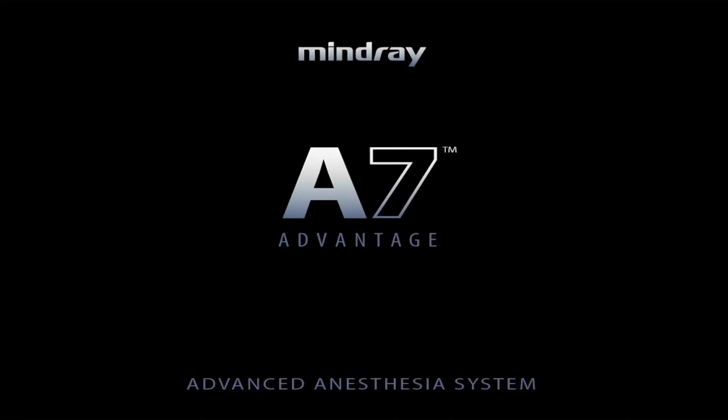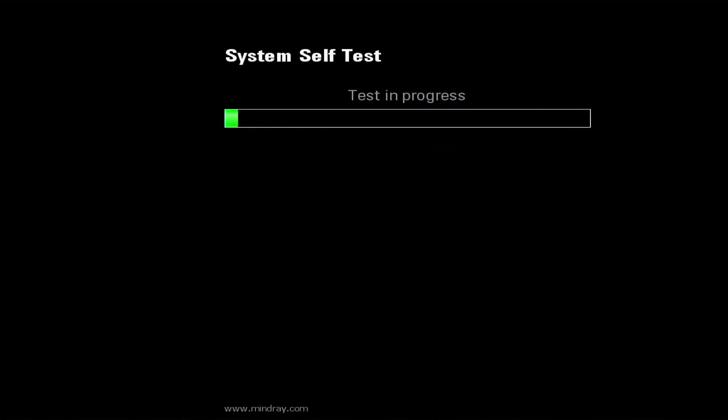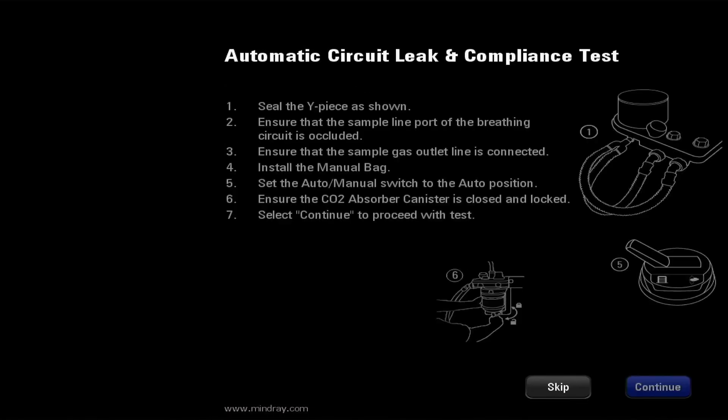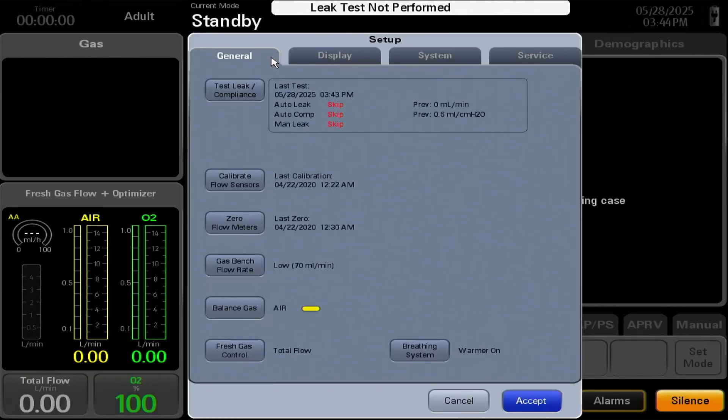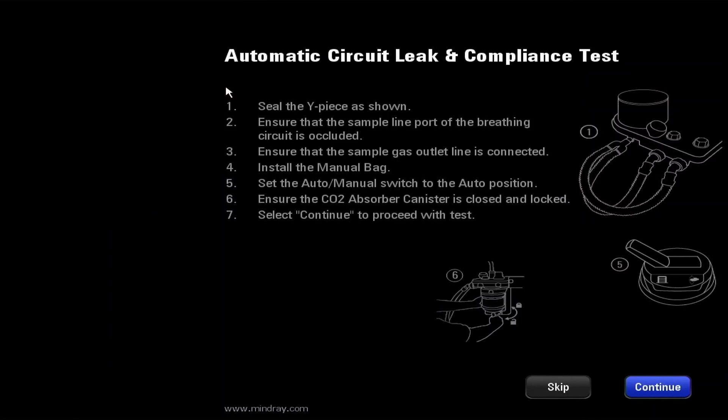Once the setup is configured, the auto leak test can be performed by either turning the machine on and allowing the system self-test to complete, then following the on-screen prompts, or by pressing the setup button, then in the general tab, pressing the test leak compliance button and following the on-screen prompts.